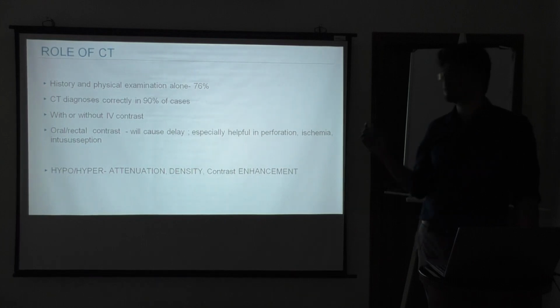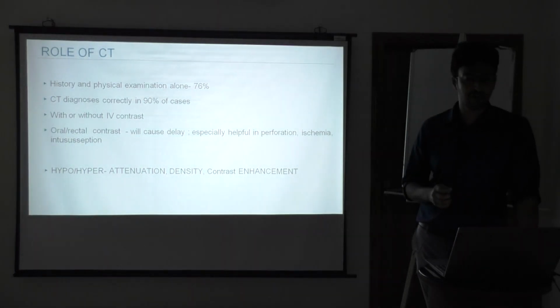So the next question is, does he really need the IV contrast or not? I really believe this is the most important question. Even if you ask for a CT scan, the question is, does he need an IV?